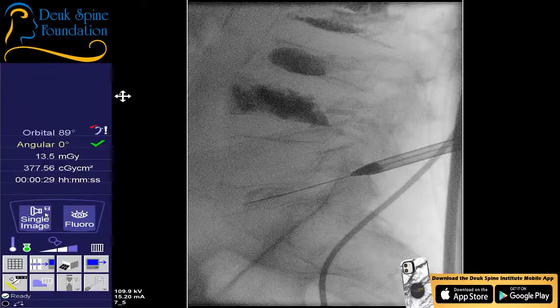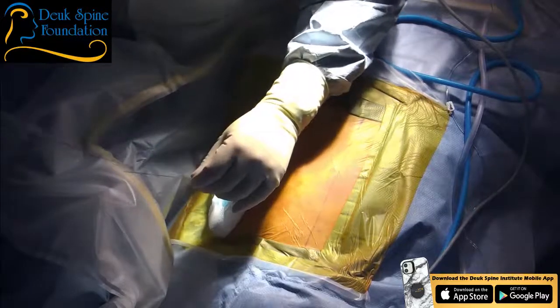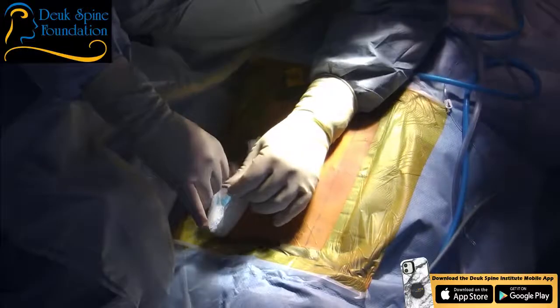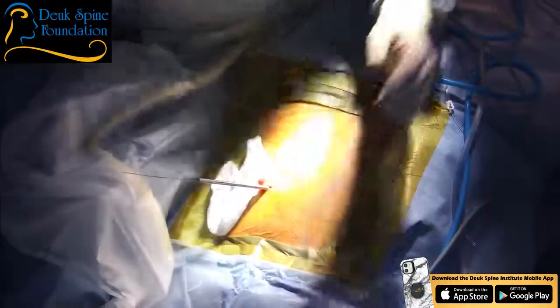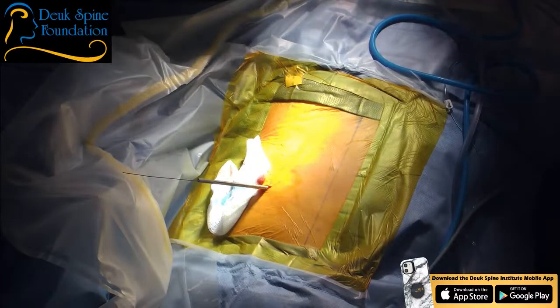All right. What percent bupivacaine? 2%? And the lidocaine is what, 1%? Half percent? What? Oh, lidocaine, then what's the bupivacaine? Oh, 0.5%, okay. All right, so we're just outside the neuroforamen where the nerve is.